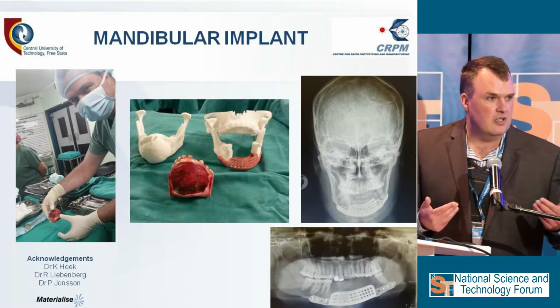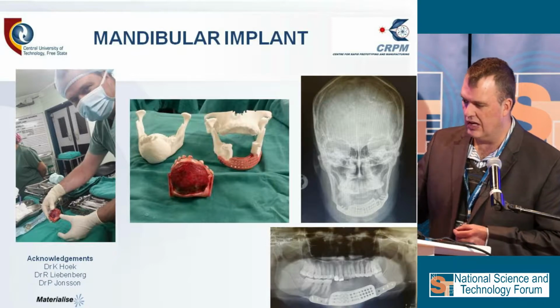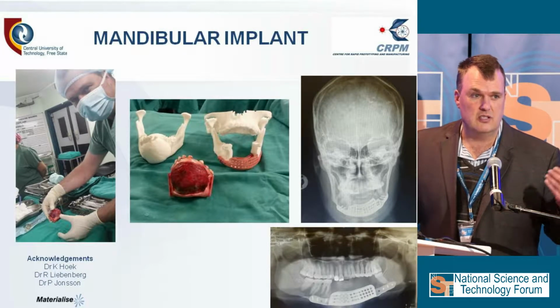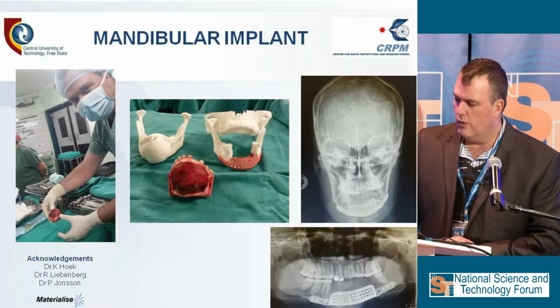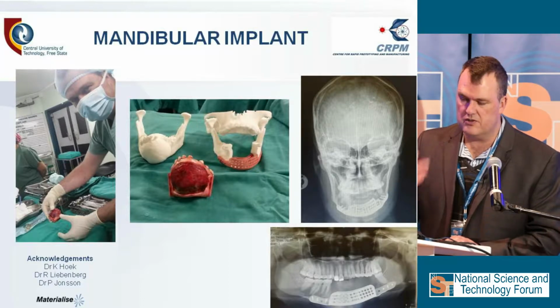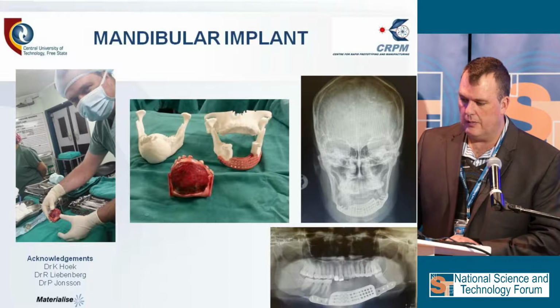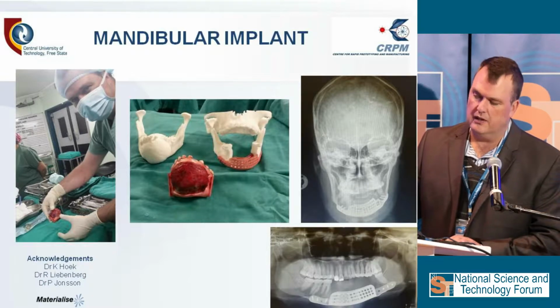And as designers and engineers, we must be in theater to actually see this. So it's not the nicest, but this is working very well. You can really save maybe 30 to 40% theater time by using this. And we're trying to convince Discovery and all of these big medical insurance companies that this is the way forward. You can go and have a look at the video that was covered by Carte Blanche, 3 mandibles, 1 day. And again, here was a reduction of around 35%. Follow-up is very important for us, to do the clinical follow-up, and then also in our ISO environment to bring that information back.